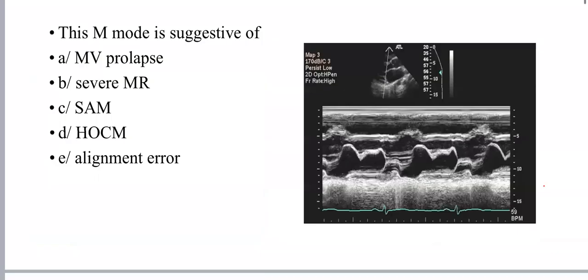Here, this one here, if we do this one, you see this part. Okay, I mean this part actually. Just a moment. Sorry. Eraser. This part. Look at this part. It's supposed to go like a straight line, but now what I have is part of it going down. Okay, this is basically the posterior leaflet prolapse.